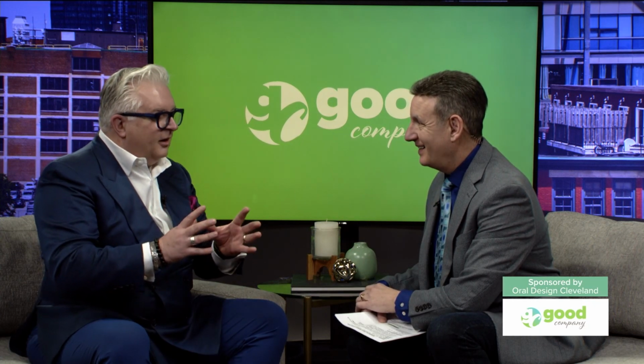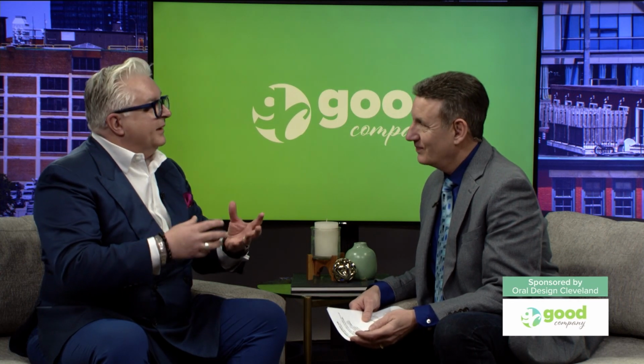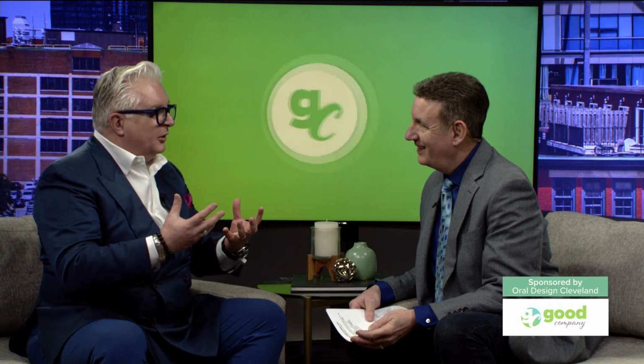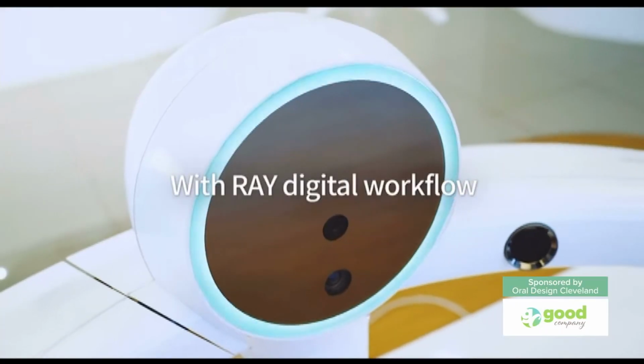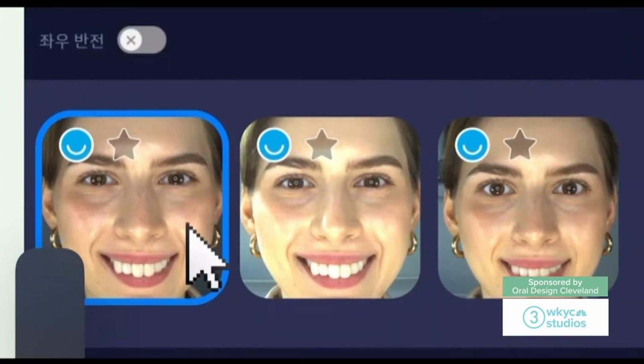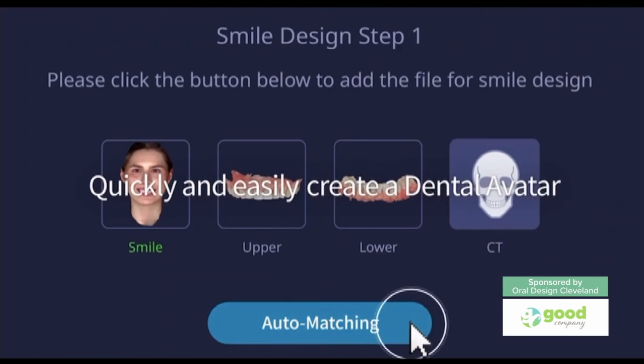Exactly. I'm able to share the possibility of that new smile with the patient with the digital smile design. But then the laboratory can create the 3D version, the actual version, by using a digital avatar of a person. And this is the RAYface, where it's using 6 cameras, taking pictures of the patient and creating a 3D patient.